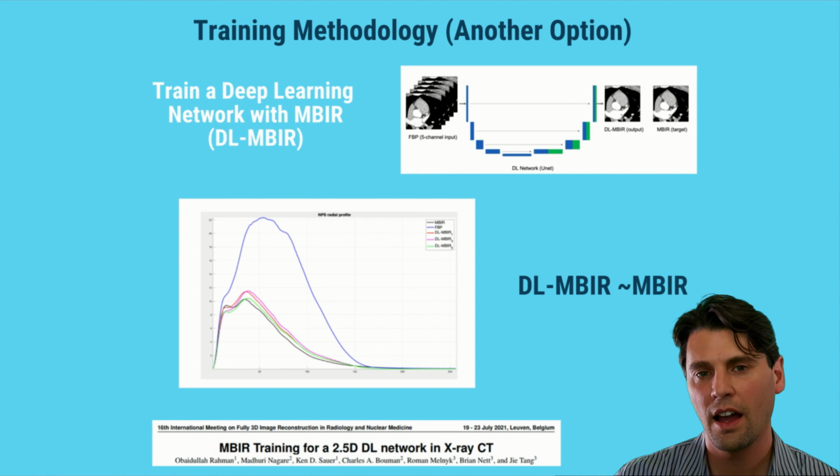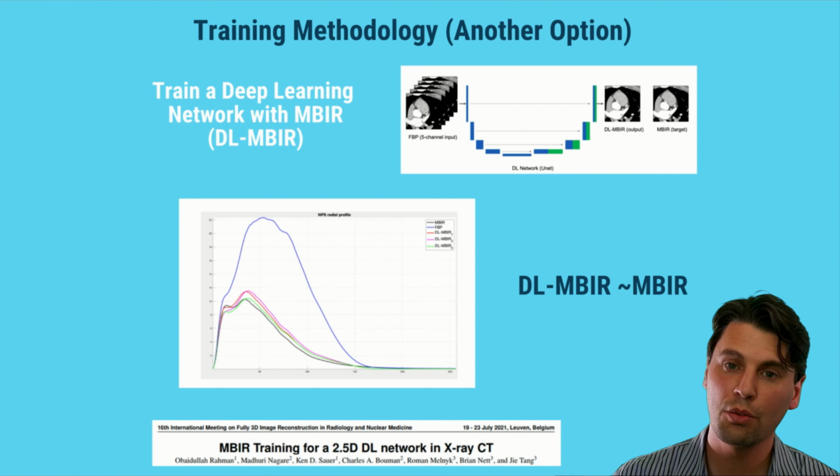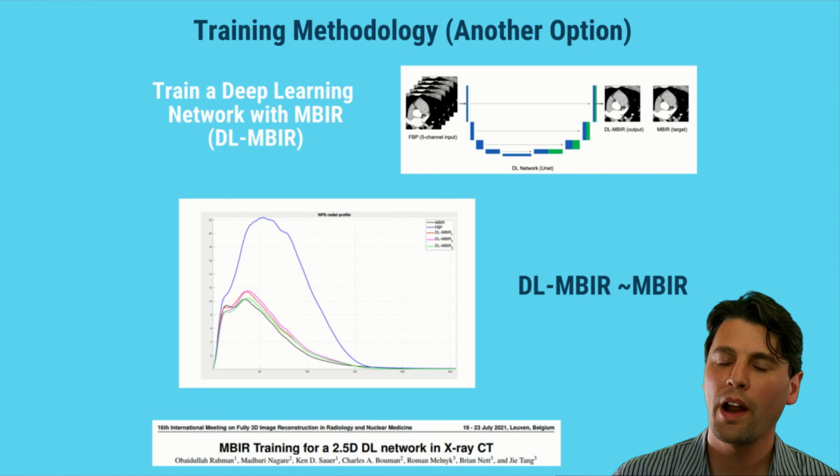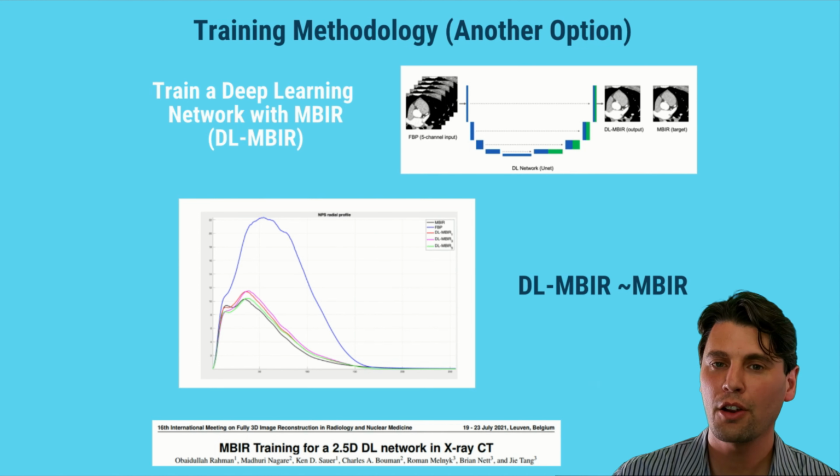So again, with DLIR, we wanted to have it be more similar to the filtered backprojection, but one option is to use model-based iterative reconstruction, wherein it is possible to have a texture more similar to what you're used to in your model-based iterative reconstruction.